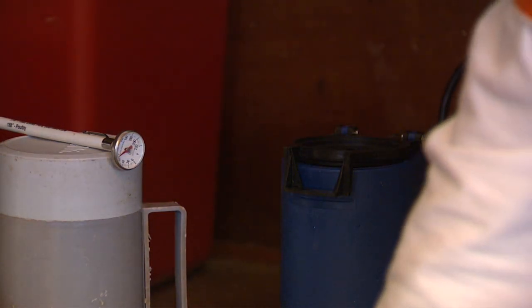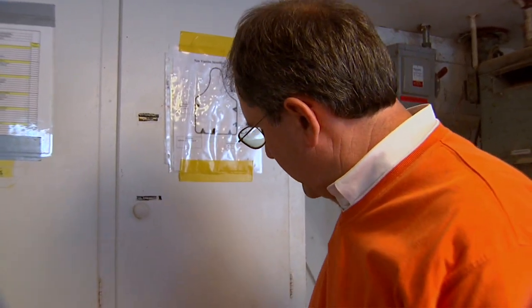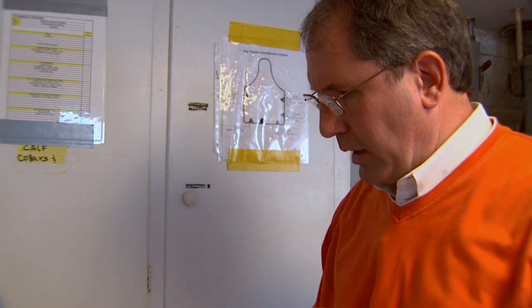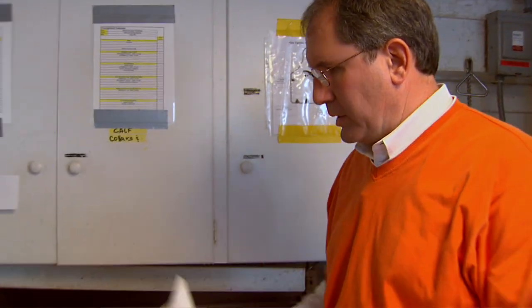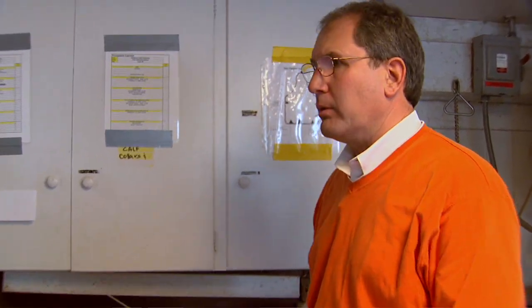While this unit of semen is thawing, I'm going to go ahead and take a paper towel. It was pretty chilly last night and we're going to warm this gun up so we won't experience cold shock to that semen. High temperature can also be a problem.